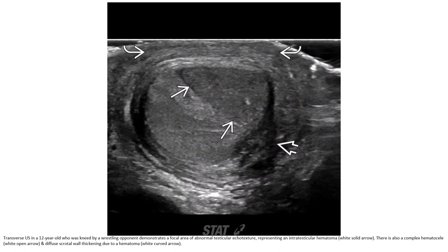Transverse ultrasound in a 12-year-old who was kneed by a wrestling opponent shows a focal area of the testicle that is hypoechoic, representing an intratesticular hematoma. There is also a complex hematocele and scrotal wall thickening due to hematoma.